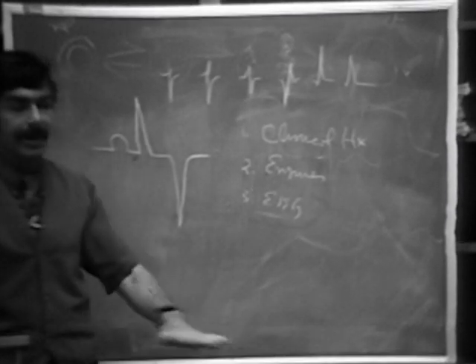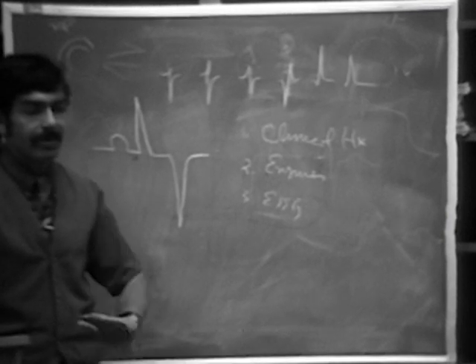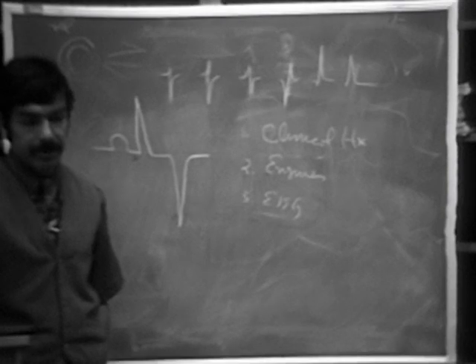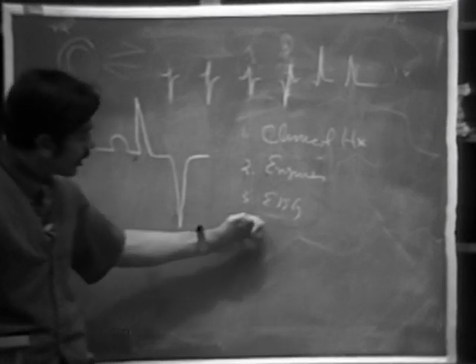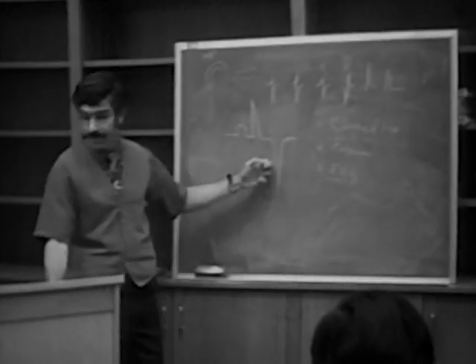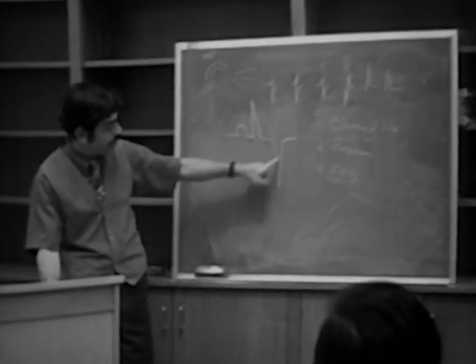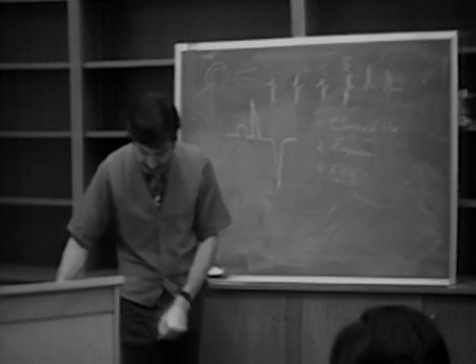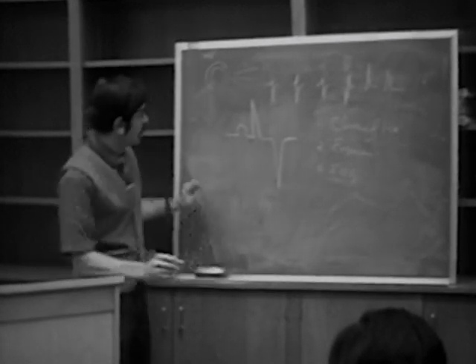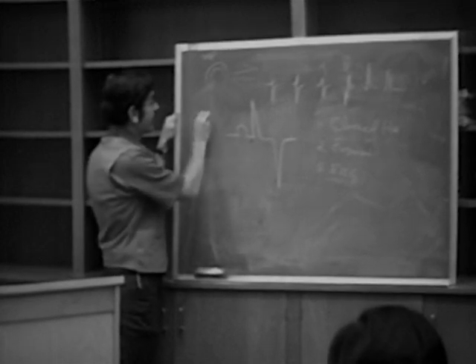It can't be here today and gone tomorrow. That change should be there for weeks in order for you to have EKG confirmation of this diagnosis. This is what you see: deeply, symmetrically inverted Pardee-type T waves. Okay, so that's your intramural.